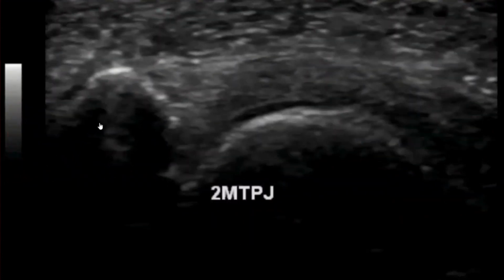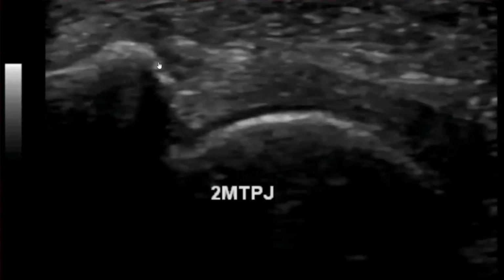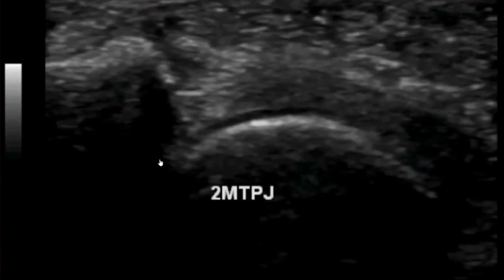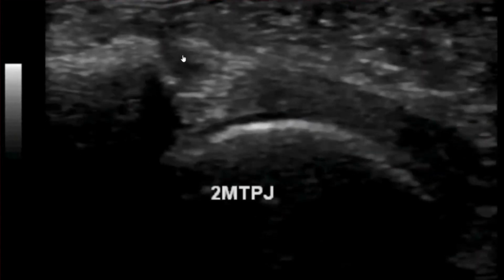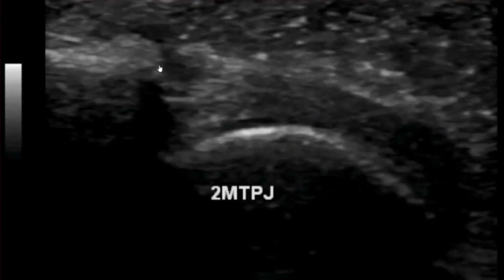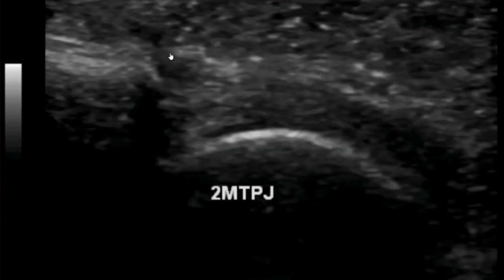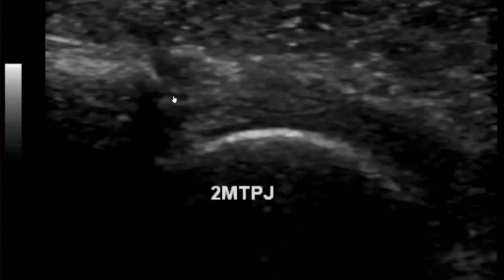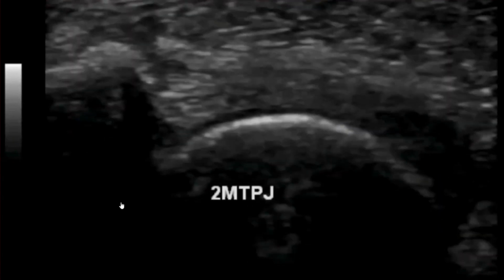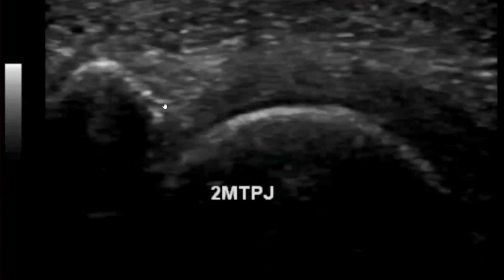And what we're seeing here at the proximal phalangeal base, as we plantar flex this, we're beginning to have a situation where we can dissociate the articulation. We're seeing a partial tear of the plantar plate itself as it attaches on the proximal phalanx, this rent here. Of course, we can see that it's going less than 50%, and we're going to then sublux or attempt to sublux this articulation. Noticing the tear here.